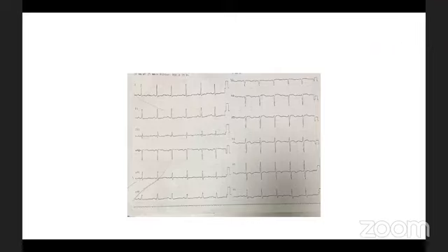Professor Hassan sir, can I supplement something? Regarding this ECG, is it rational to start STEMI activation, I mean emergent PCI? In this case in the emergency department, there are non-specific ST changes. Why not CT to rule out, triple rule out, as back pain is more than chest pain?